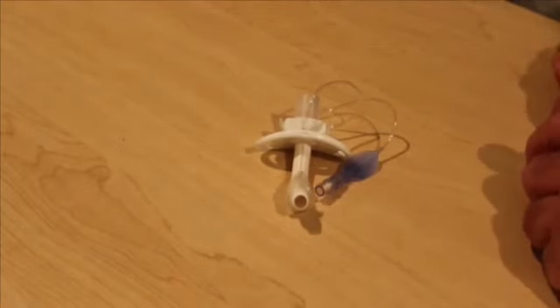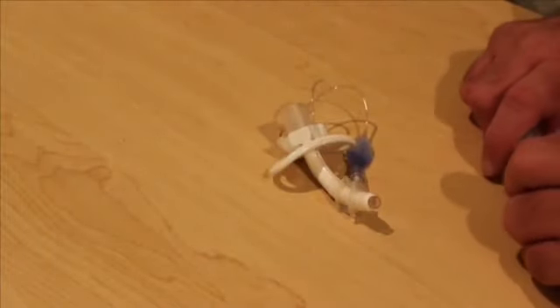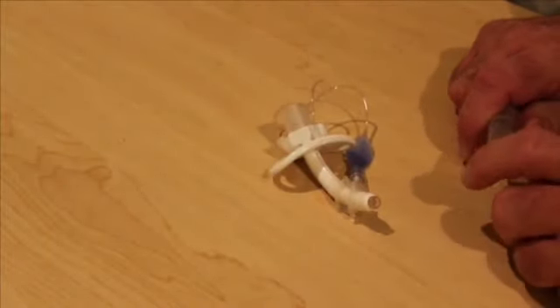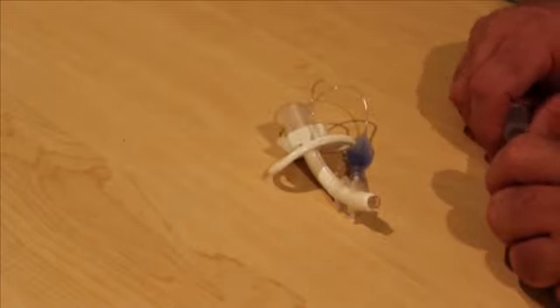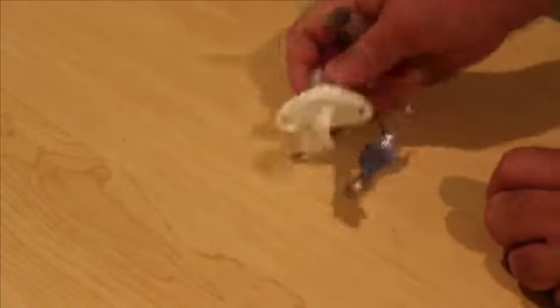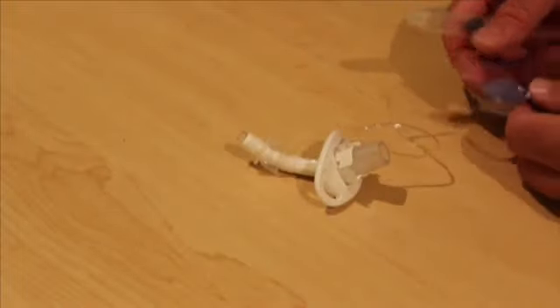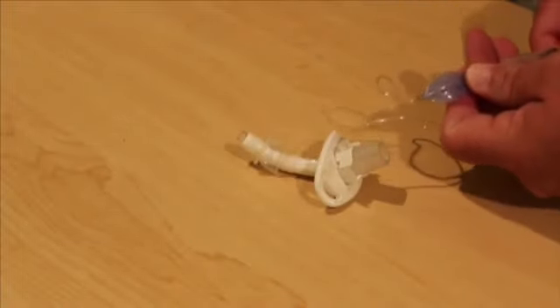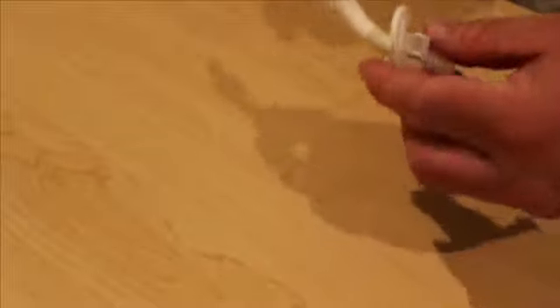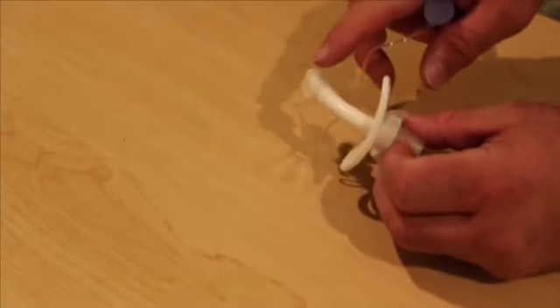In the past, all the trach tube cuffs have been filled with air, which makes sense because it's going into your airway and if it popped you didn't want the water going into your trachea and into your lungs. But with the typical air filled cuff, when you do deflate it all the way, it leaves a lot of extra material around the tube.